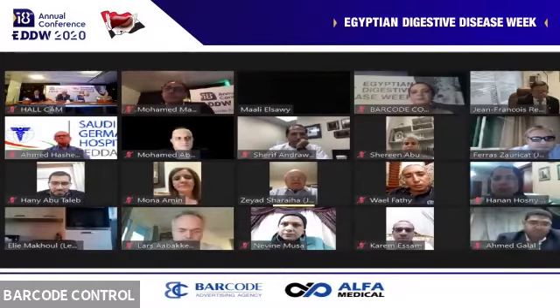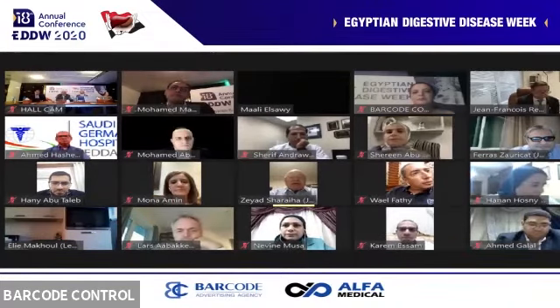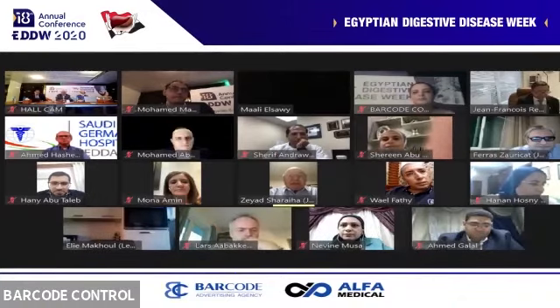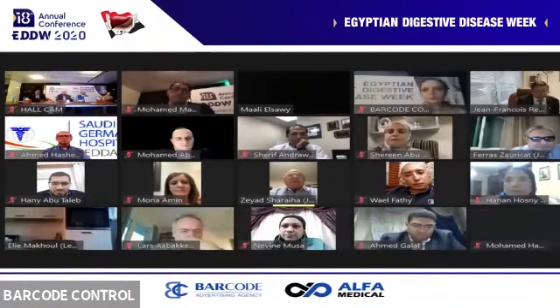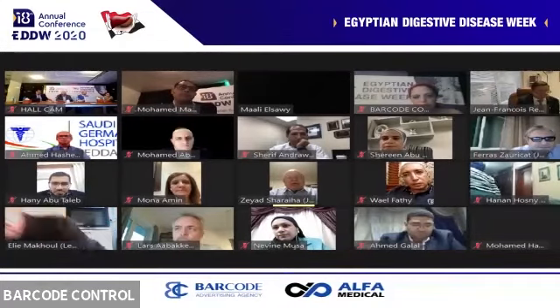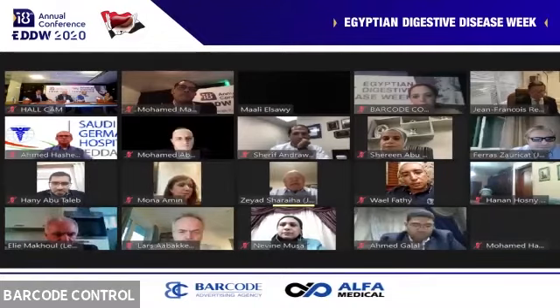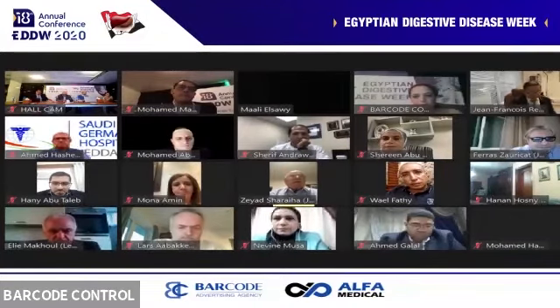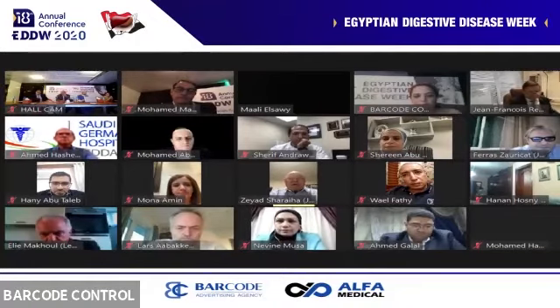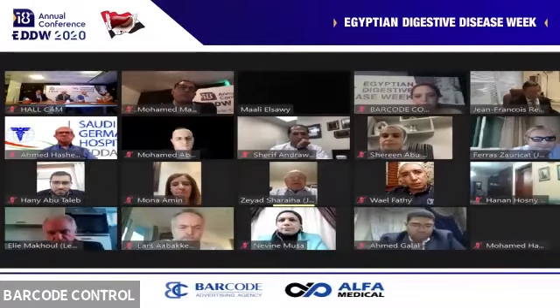But as our commentator has said, we should really all have international guidance for writing the reports very well. And I see the differences here, whether you have hernia, whether you have reflux, LA reflux, and you can see almost 60% of the reports that you have a grade A or LA reflux.